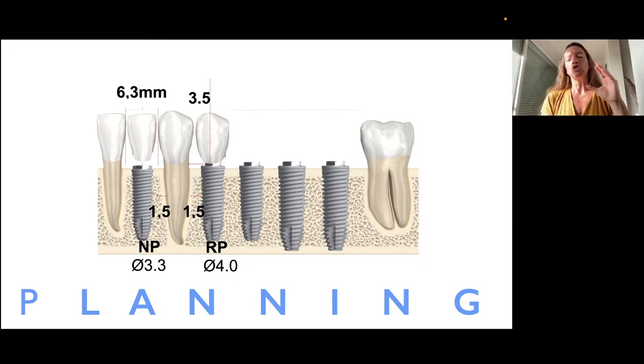Of course, you should do some guides if you want, surgical guides, where you can place the crowns, where you can have everything already planned, and then you use those guides to know exactly where you should start to drill and where you want to place your implant. But if you don't have the guides, you have to understand the basics, okay? If you go freehand, the basics are these ones. You have to have this knowledge to know exactly where you have to drill.